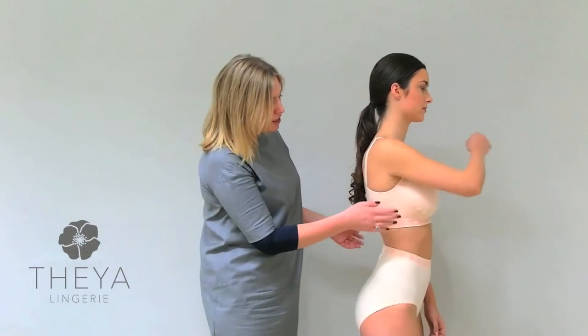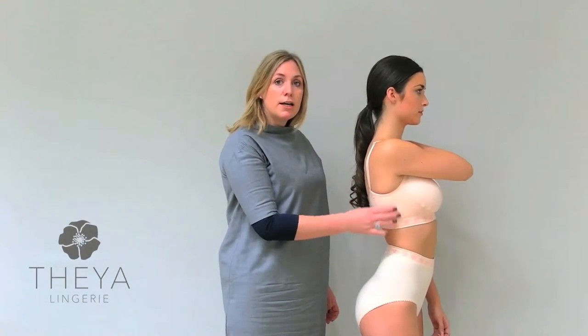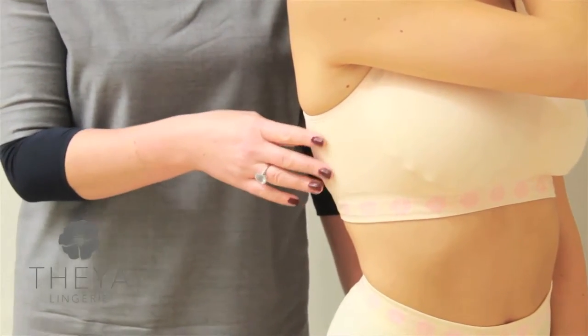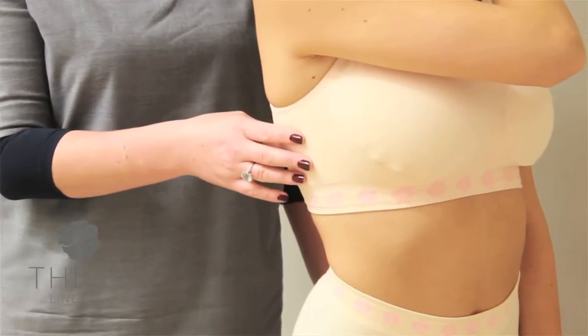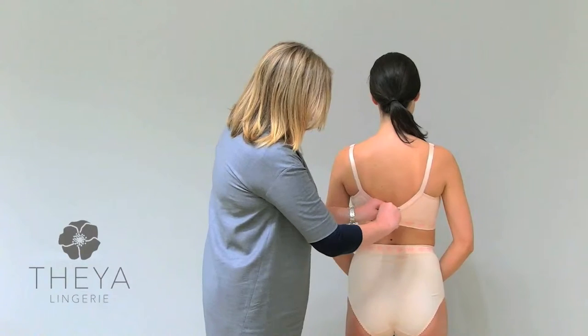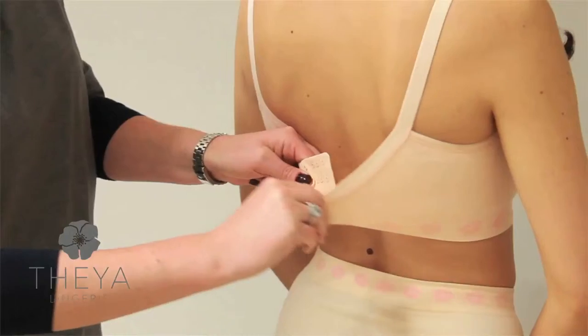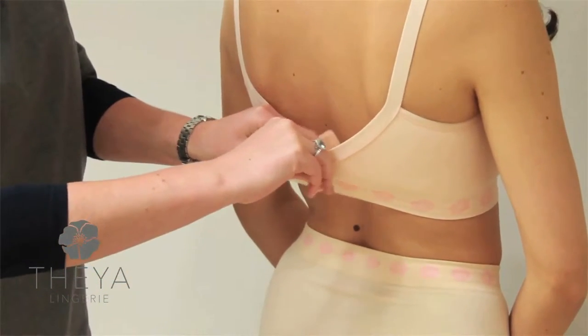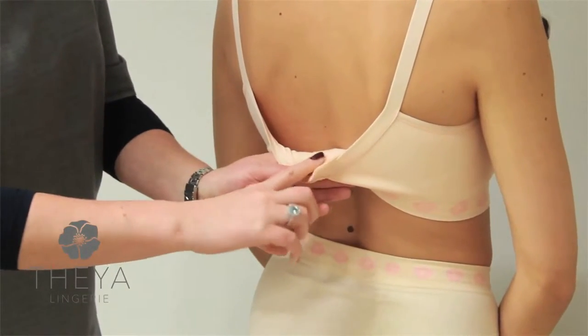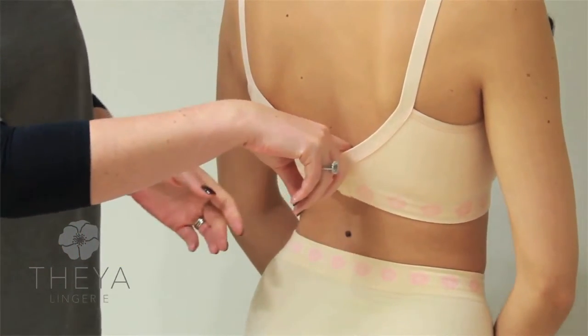As you can see on the side, it sits quite high underneath — this is to give support for ladies who may have had some of their lymph nodes removed. Turning around to the back, it closes at the back and has four levels of adjustment, which means it can accommodate different amounts of swelling. The back is also super soft, so there's absolutely no irritation.